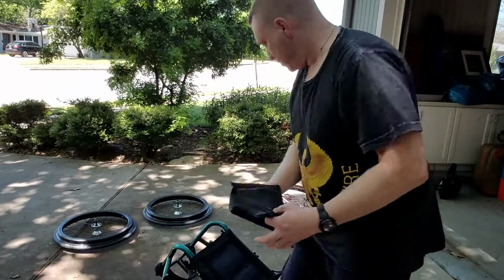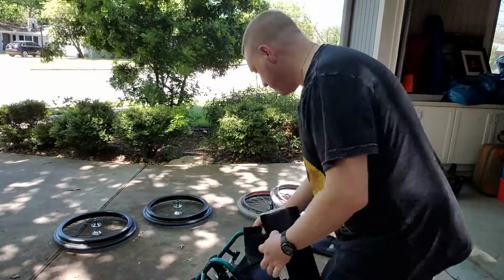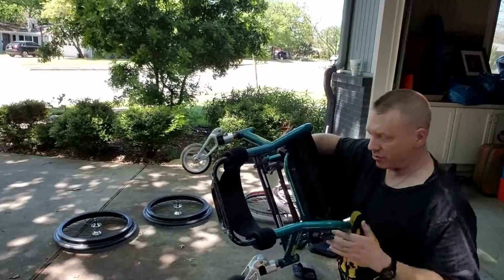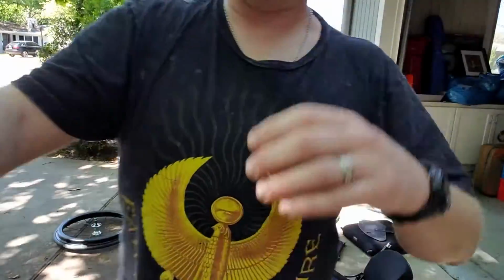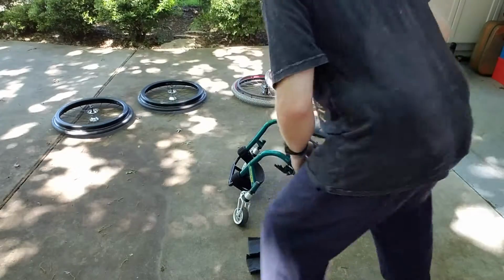First thing we're going to do is attach these two foam pads that go on this part of the wheelchair right here. Angle this down a little bit so you can see a little better what I'm talking about. All right, it's pretty straightforward.